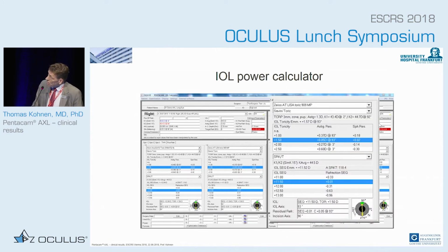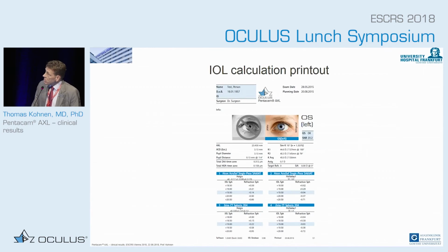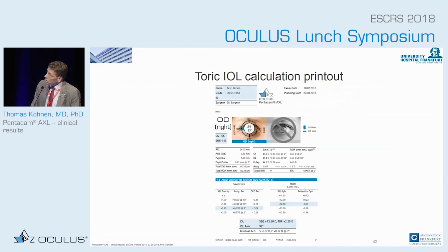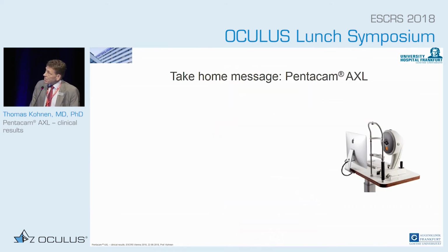So you take calculation. Here's one of our speakers, the Savini toric calculator, for example, and you come up directly with an IOL, which gives you the spherical power and also the power of the toricity. And this is done in the IOL printout, which I showed here, and just a couple slides from this measurement. Take a look yourself. I think this is really the model.